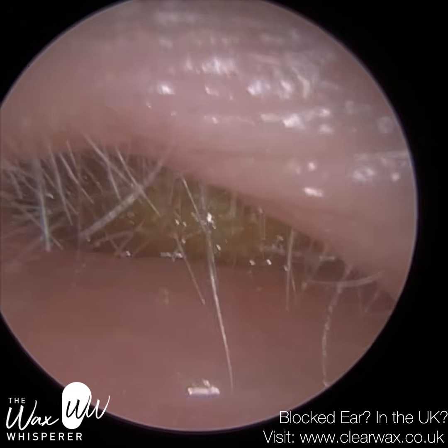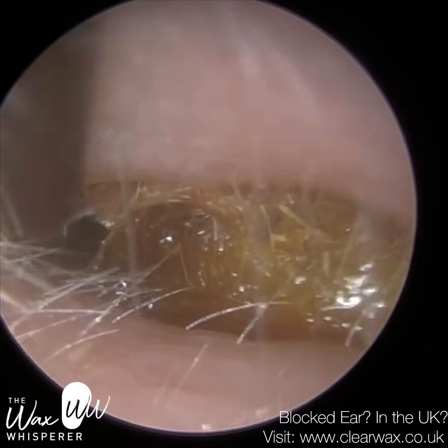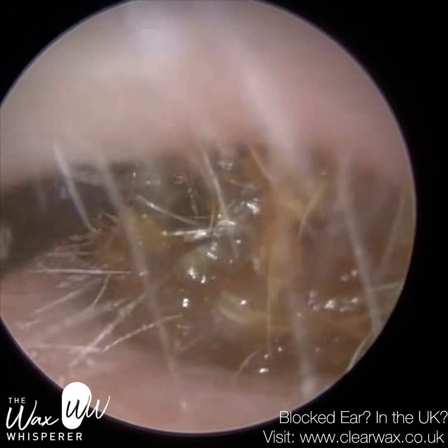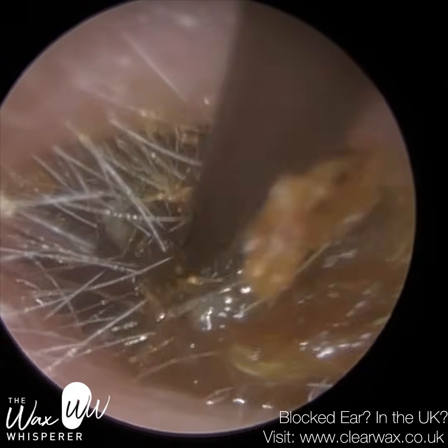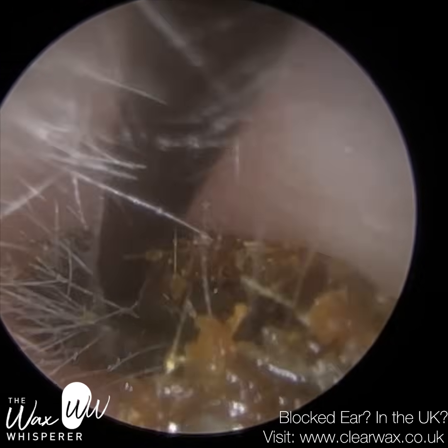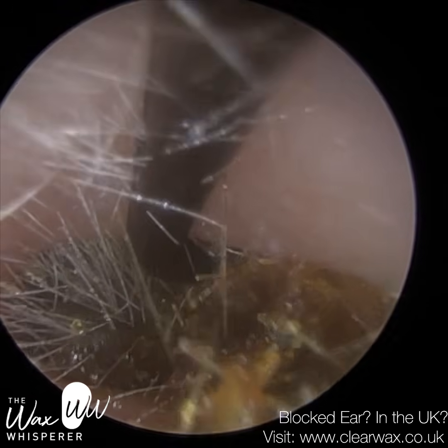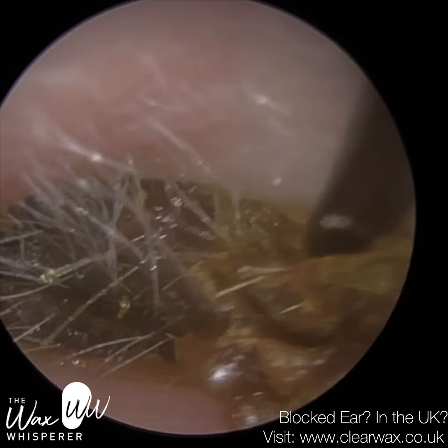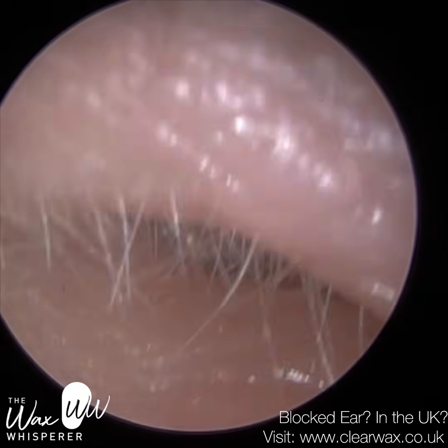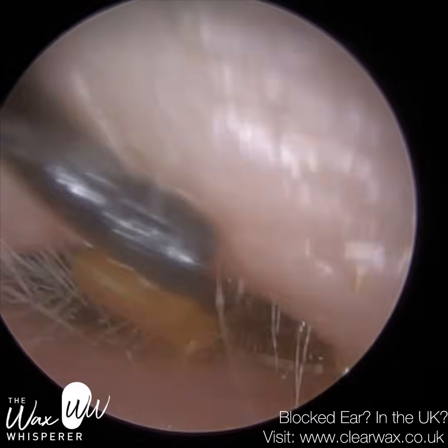So I've just put some oil in here to lubricate this. I've used a bit of suction, just using the ear hook, trying to get in and behind. The ear is quite bendy as well, so when we insert the hook, I've just got to be careful that I don't inadvertently go close to the side of the ear canal walls, because we don't know what's behind this wax. Occasionally you can have some surprises. You can have an extreme narrowing, so stenosis of the ear canal, where the bony part of the ear canal really narrows, and if you're not careful you can make contact with that with the ear hook.